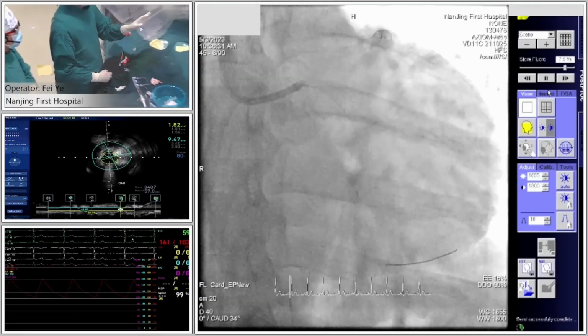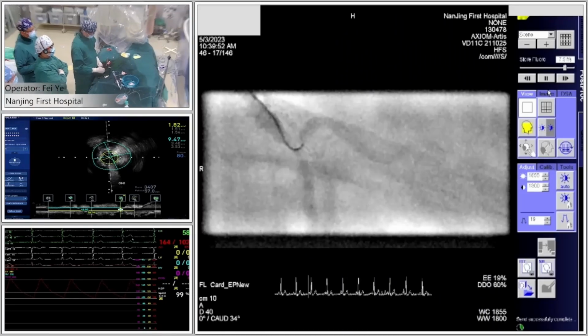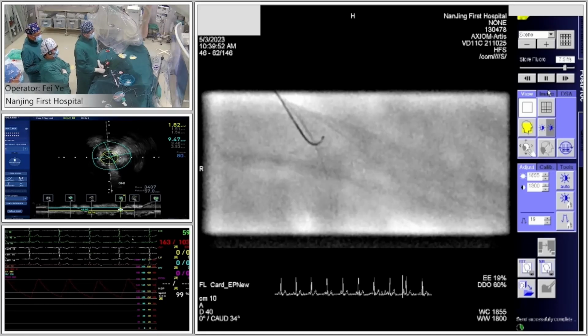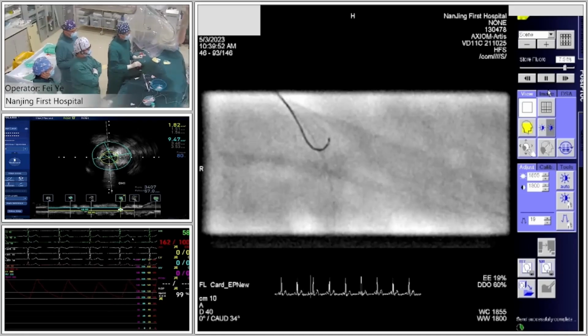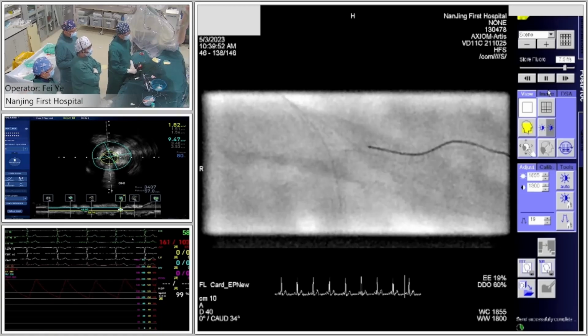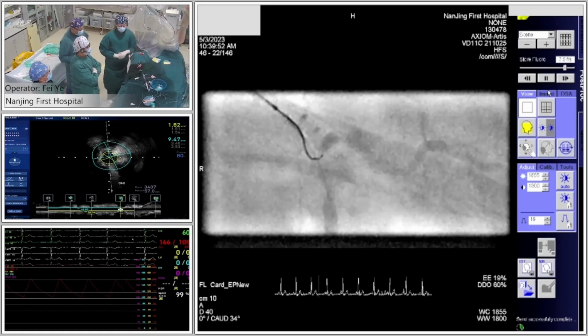This is a microcatheter exchange procedure. You can see here, we zoom it. We cannot push the wire, just torque, just rotate. Make sure you can find the wire tip in the OM easily. Yeah, excellent technique.